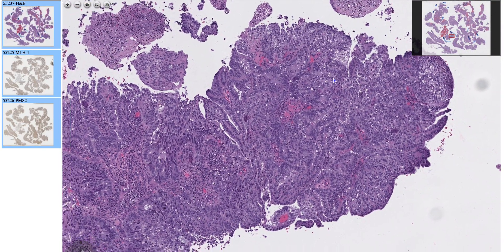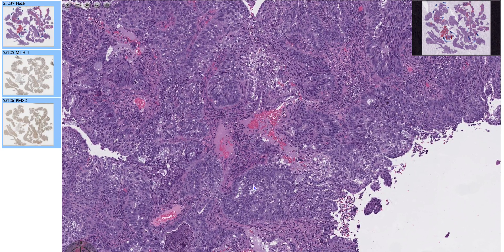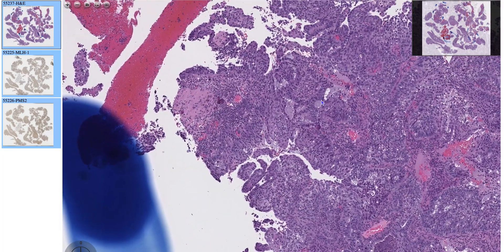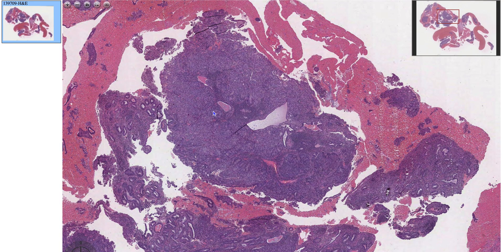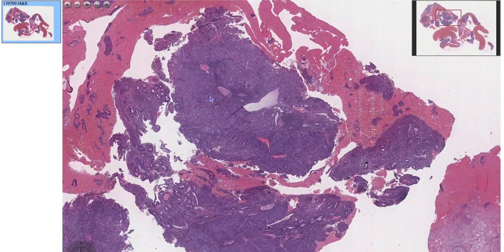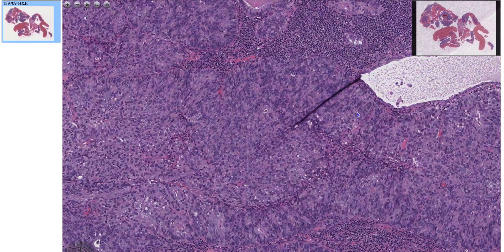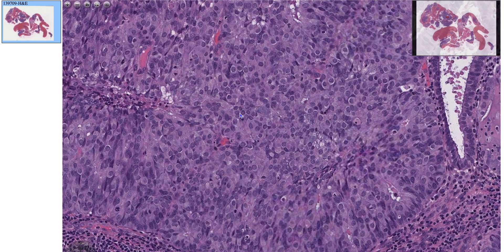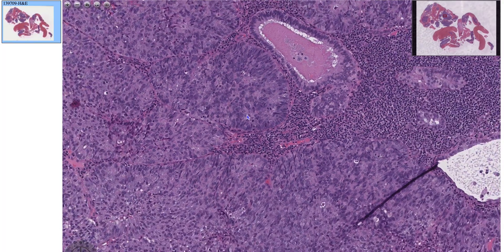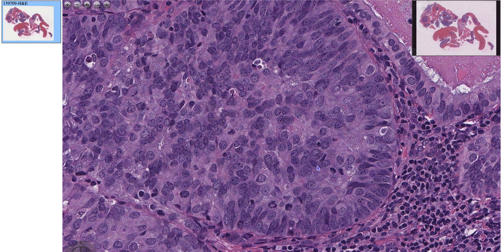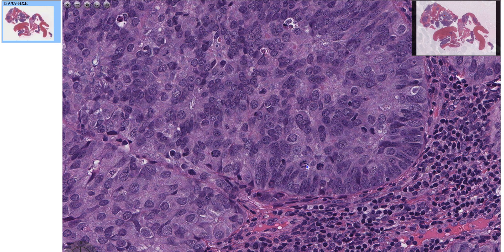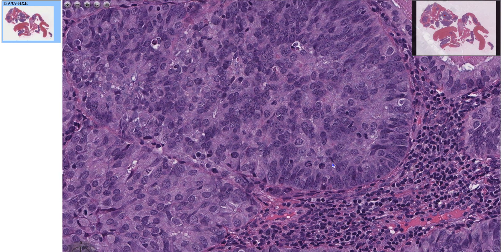Here's another area of endometrioid endometrial carcinoma with a little bit of solid growth and maybe a little bit of cribriforming. Now for FIGO grade 3 — from low power this looks like stroma, but as you zoom in, this is all epithelium. More than 50% of this is solid, non-squamoid growth, so this was considered FIGO grade 3. Here you can also see mitotic figures back to back, so it's highly active.